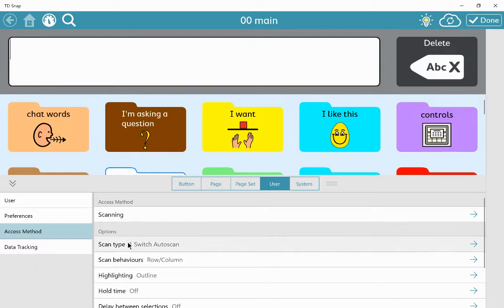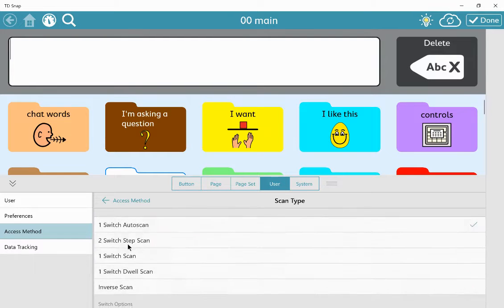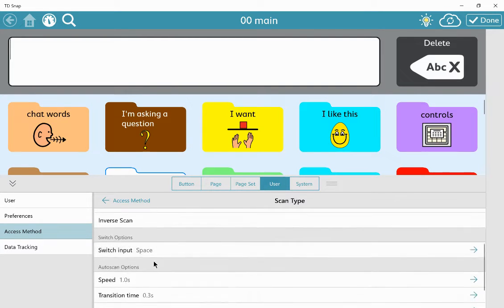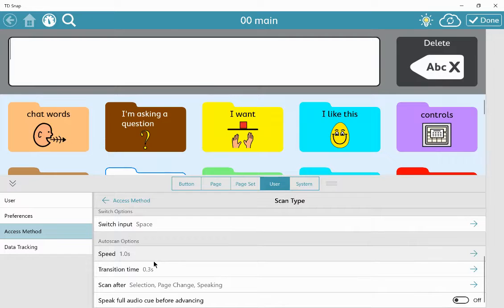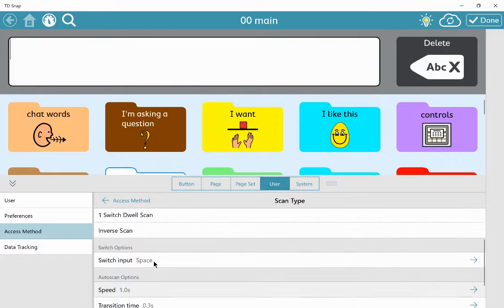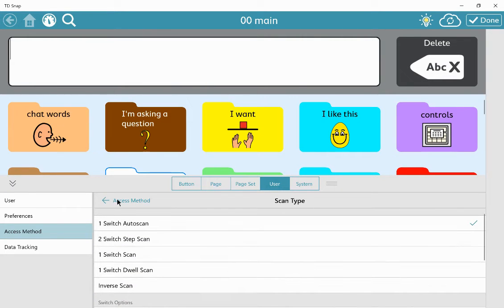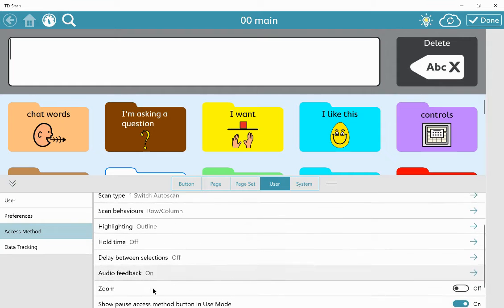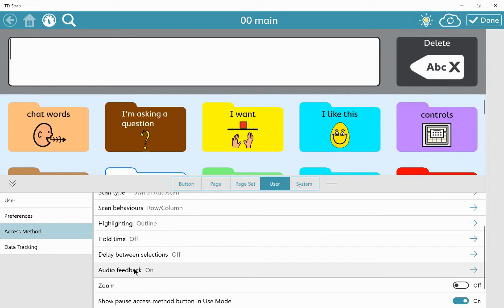Then if you click back, you've got options of what type of scan. One of the key things if you're doing auditory scanning is that you will need to turn on audio feedback.